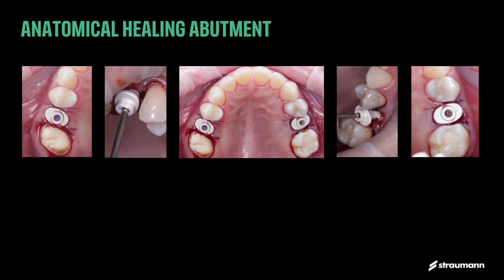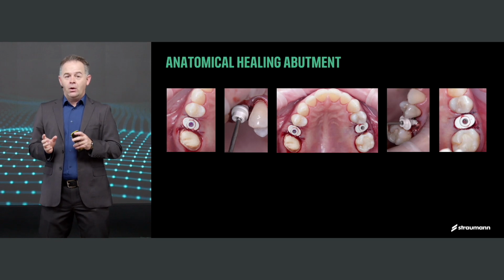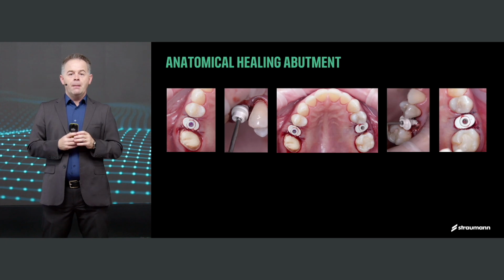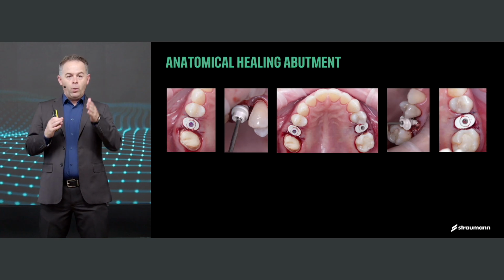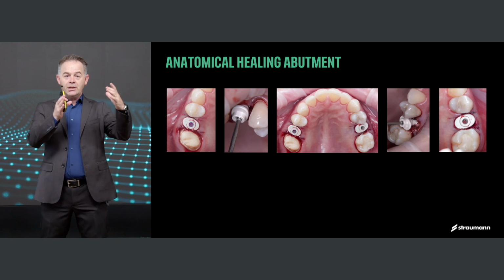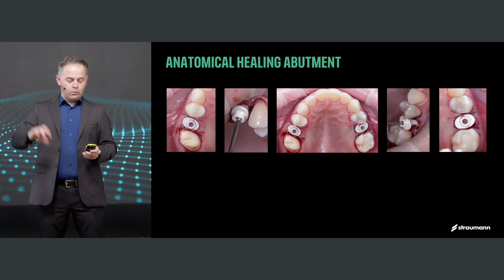Next thing we do is select the anatomic healing abutments. Remember, already considered in the beginning in the planning, we placed the medium-size healing abutment on tooth 15 and also on tooth 25. You see that it seals the socket very beautifully. But look how these two sides, even though very different, one had an incision and the other one was a flapless extraction with immediate implant placement, I was able to bring the tissue back and suture with single sutures mesial-distal on both sides, and this is how the patient goes home.